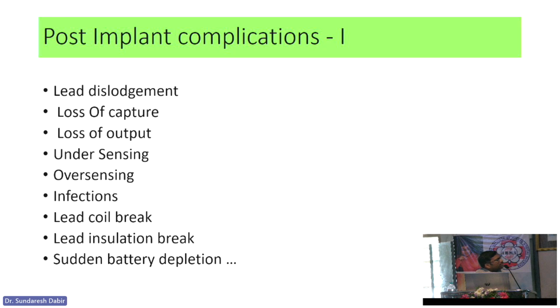So he says it's one spike, I will call this single chamber. Here two spikes, so I will say it's a dual chamber. No, sometimes, right, sometimes it is not always. That's what Anand is telling you. It is not always two spikes for dual chamber. Yes, when you see two spikes, it's dual chamber pacing.